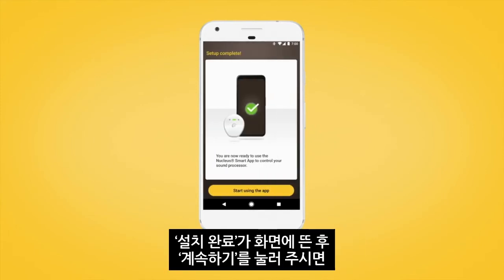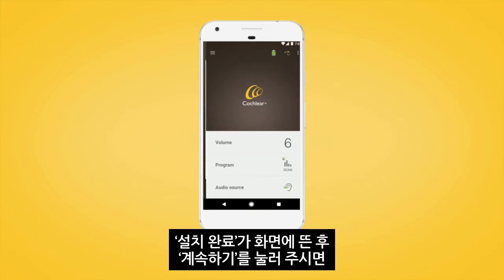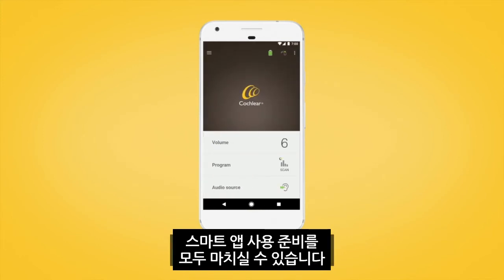When the 'Setup Complete' screen displays, tap Continue, and you're now ready to use the Nucleus Smart App.